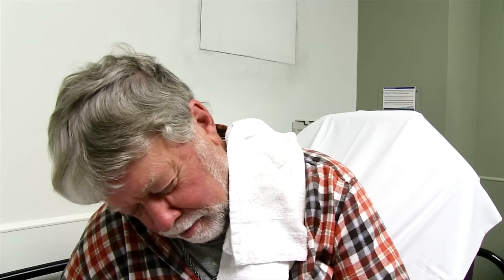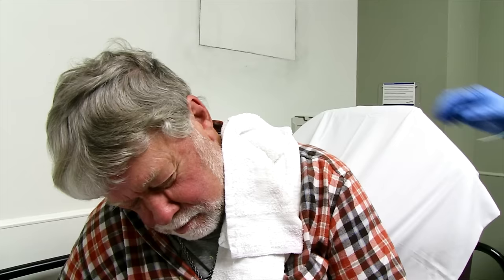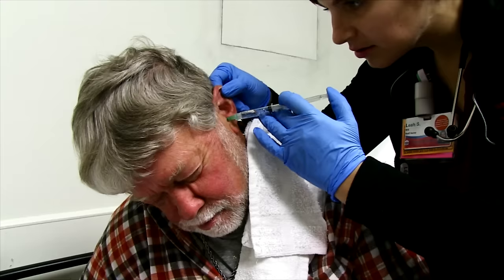It looks like it's starting to loosen up, but there's definitely still a good bit in there. Do you need to put more Colace in there? Probably. I'm gonna give it one more go and see if any more starts coming out, and if not, we'll probably do the Colace again.